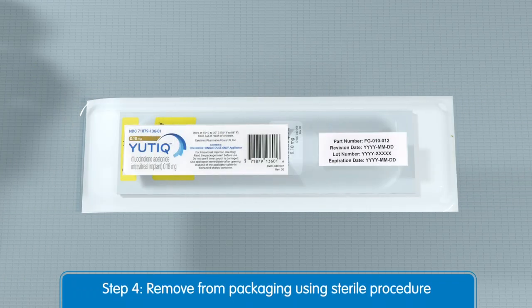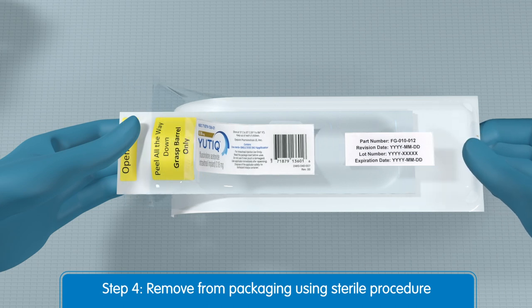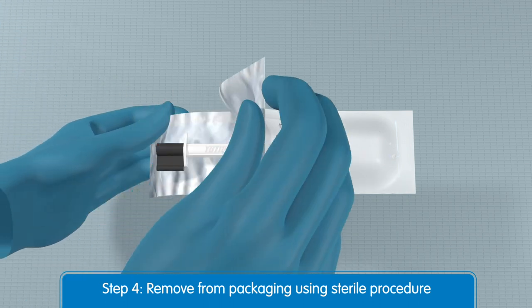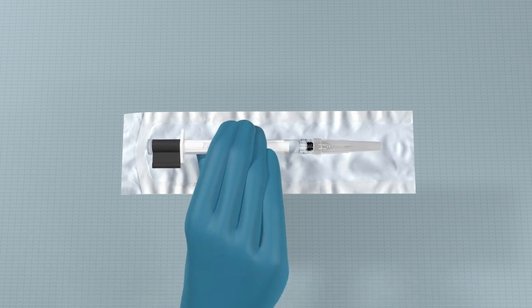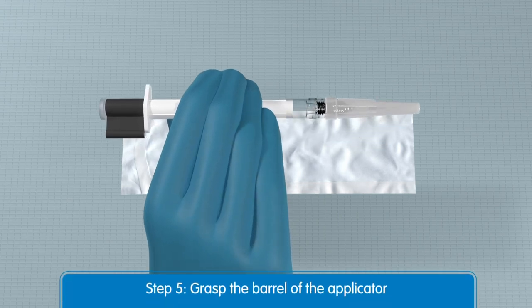The Utique intravitreal injection is supplied in a sterile, single-dose preloaded applicator with a 25-gauge needle packaged in a sealed sterile pouch inside a sealed Tyvek pouch. Make sure to use sterile procedure when opening the pouch and removing the device from its packaging. Remove the Utique applicator from the sterile pouch by grasping the barrel of the applicator, as shown here.